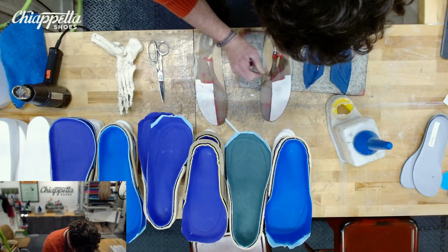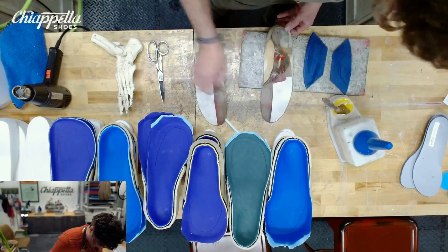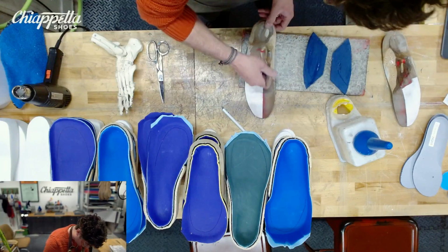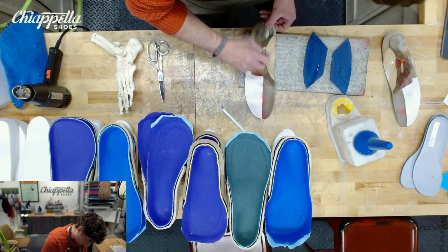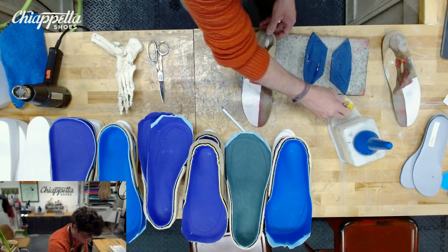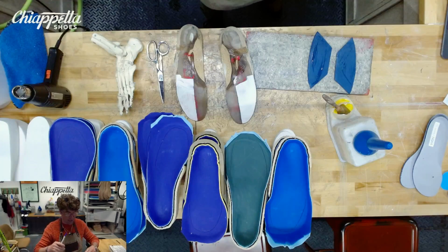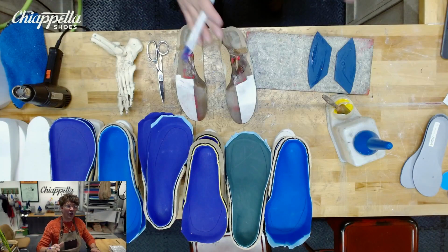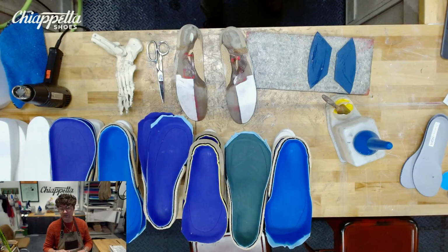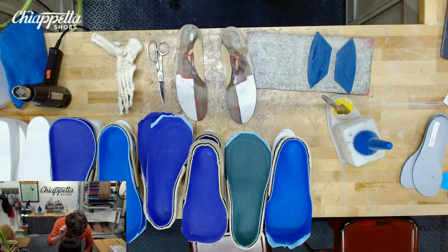The heel cushion, I'm gonna use a 6mm, 1/4 inch Sport Poron. It's the light blue stuff we use a lot. And my thinking is if we give them a little heel elevation, with full body weight, Sport Poron is gonna compress about 50%. So we're giving them about 1/8 of an inch of extra heel height. I think that'll help with this guy. He's a tall guy, hard on his feet. Any A-type feet are going to be hard on their feet. As Dr. Carl calls them, they're chandelier shakers. So we're going to get that going.